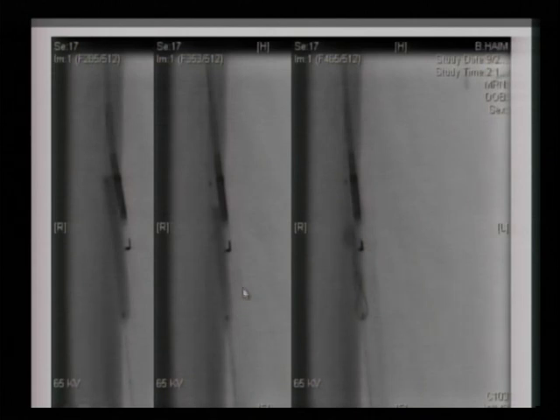This is a Maverick coronary balloon that was introduced through the posterior tibial access, and then from above in the true lumen, we've introduced this Outback catheter here. There's the Maverick balloon and the Outback catheter. We can then deploy the needle, and we actually puncture the balloon and pass a wire into that balloon.